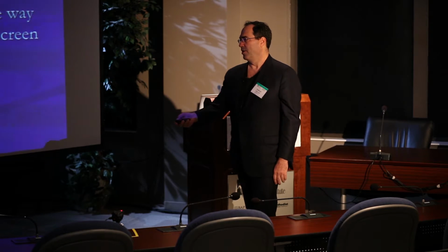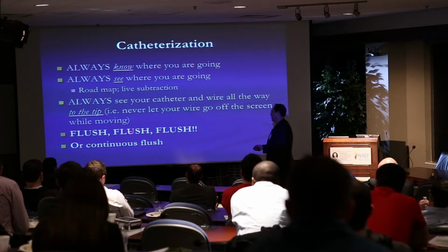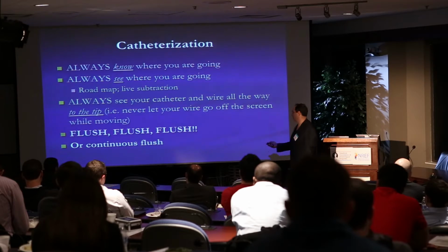And you can see here, Tibor doesn't like to use the continuous flush. I put that in down here. But flush, flush, flush: yes, you don't want blood sitting in the catheter, but with the continuous flush system, you don't need that.